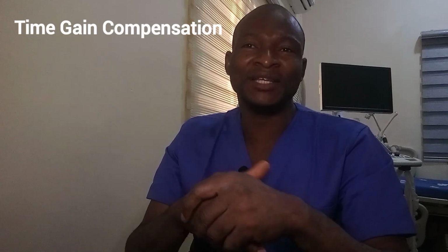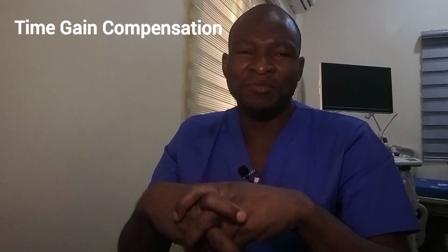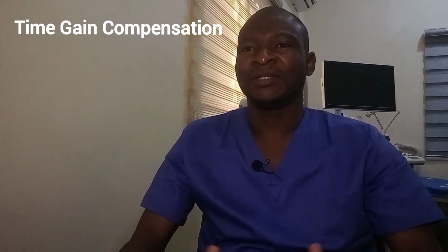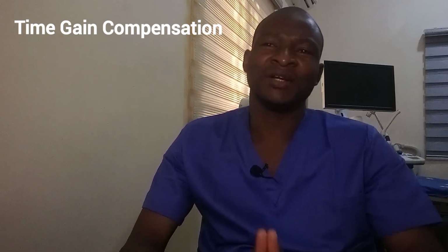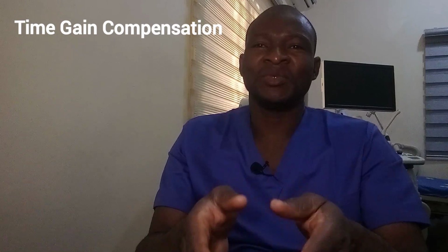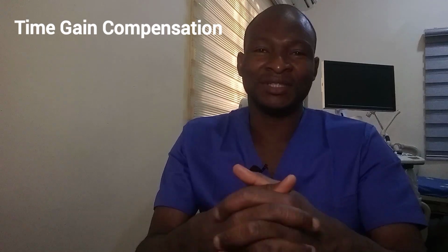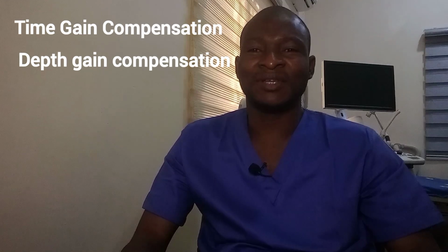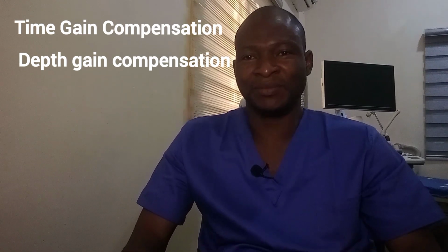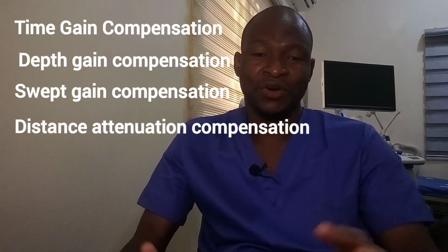And as usual, we talk about time gain compensation. We will not stop talking about it because it is relevant for image optimization. Time gain compensation makes all the echoes arising from similar structures appear the same brightness, regardless of the depth of the reflector. It is also called depth gain compensation, swept gain compensation, or distance attenuation compensation.